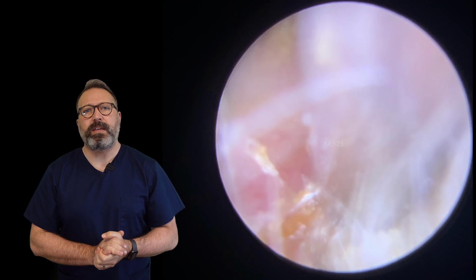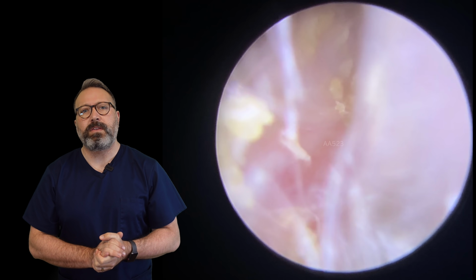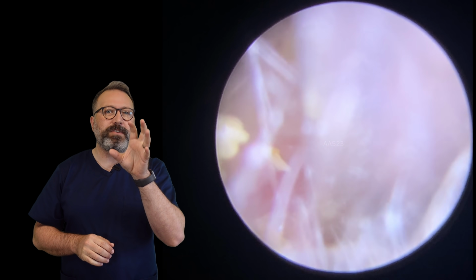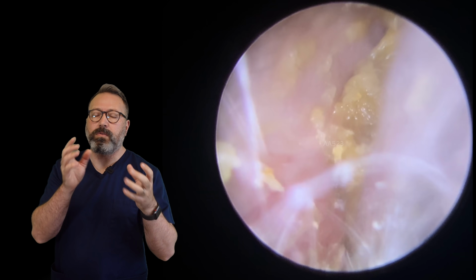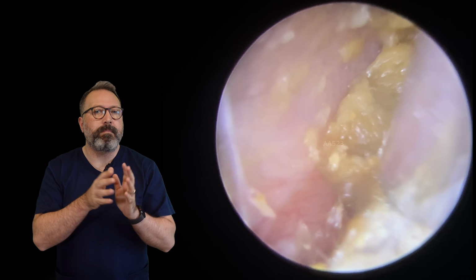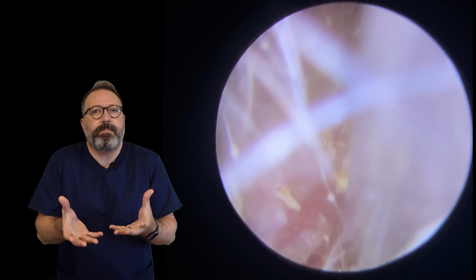What you can see I'm doing here is just lifting from the base of the canal here. You'll see there's an ever so slight tremor. You might not notice on this one, but we had obviously a patient yesterday with a tremor that was quite severe. This patient's doing very mild, so you might see a little bit of shake into the camera. But what I'm doing here first of all is detaching from the base of the canal.